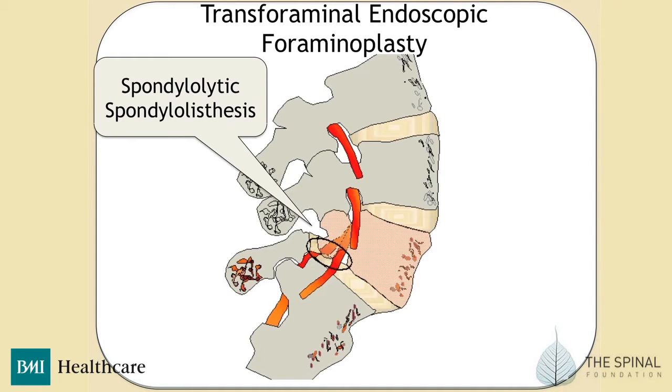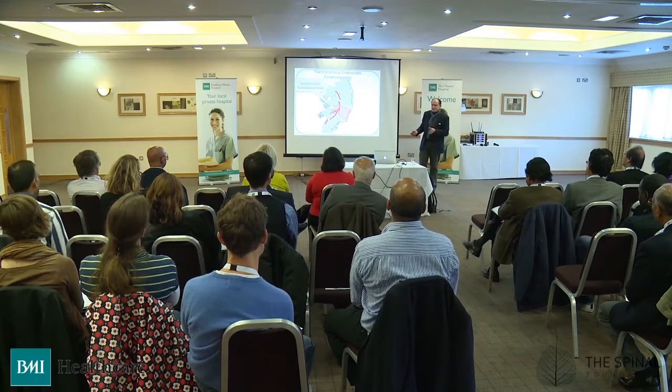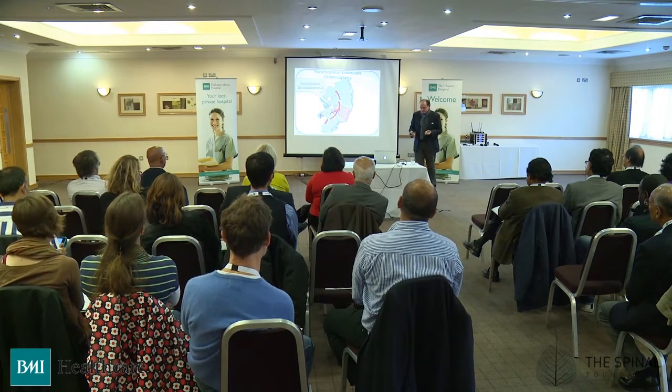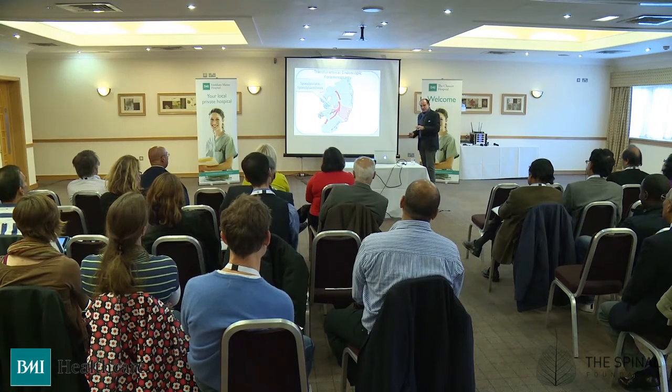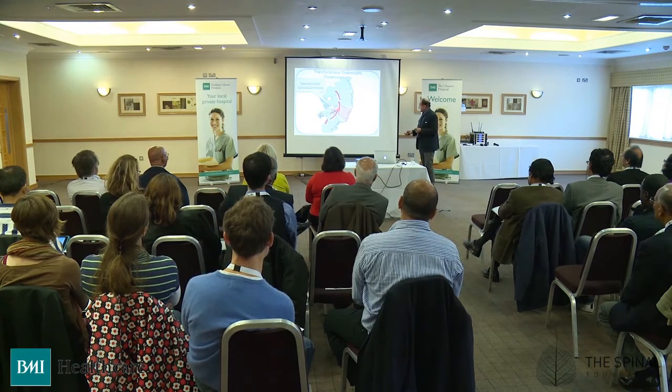Now you can take the same concept in patients with spondylolytic spondylolisthesis. Instead of having to fuse that level, in an adult, they're not going to slip further. They've already adjusted, they've thickened all their ligaments, and the body has adapted to it, and usually what has happened is you've hardly got any disc left here, but you've got a very, very strong posterior disc wall, very thick, and you don't really want to disturb that too much. And then by taking off the bone of the healed fracture site off the nerve and mobilizing the descending S1 at that level, you can treat the patient without the need for fusion. And that we published many years ago.